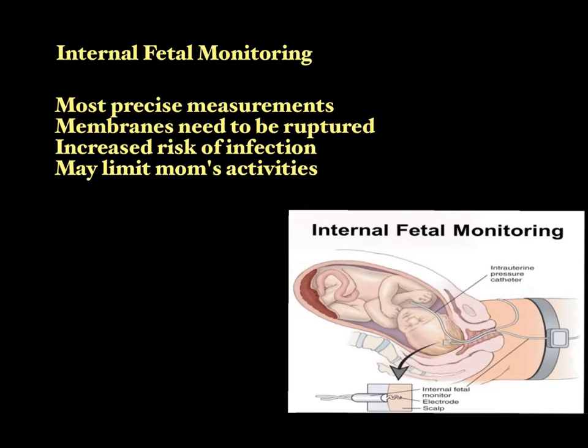The other big drawback, and I know that I have seen literature that says that one of the advantages is that mom gets more mobility because there's less loss of contact, but I really don't know too many people who are comfortable letting mom walk around. It's very easy to dislodge these devices. You do secure them to the leg. However, I feel really uncomfortable letting people just kind of get up and walk around, and so do most of the people that I work with.